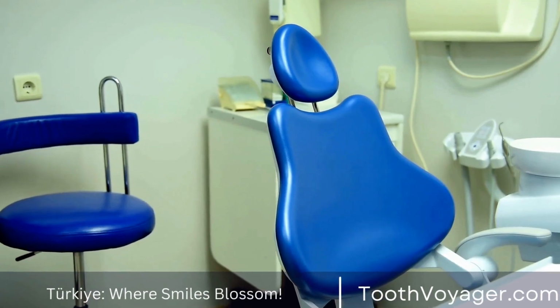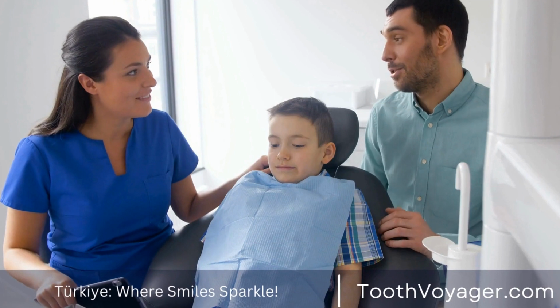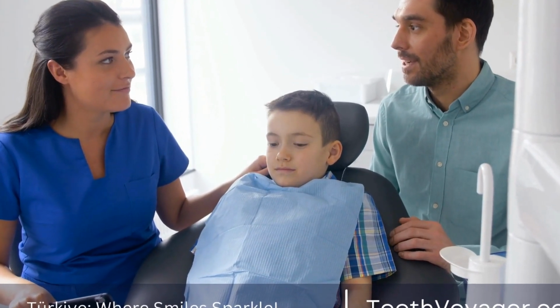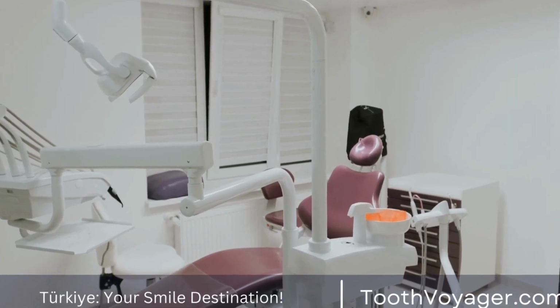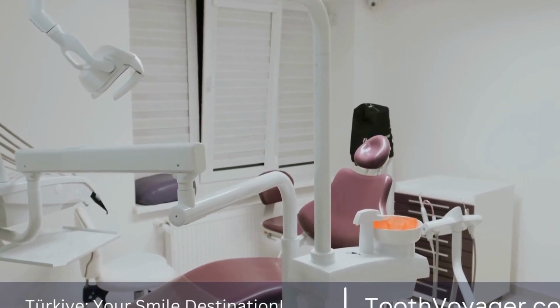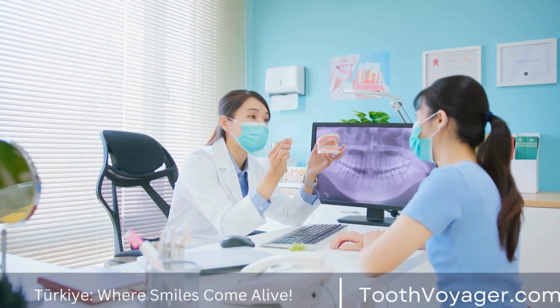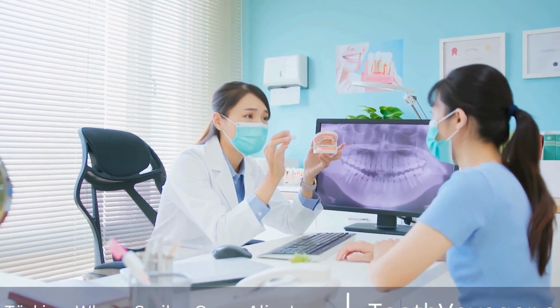Implants are a well-known and efficient solution to replace missing teeth. Implant dental treatment involves two major phases, osseointegration as well as final restoration. In this short video, we'll discuss the two phases in depth and what they do to the effectiveness of dental implants. Osseointegration is an essential process for implant dentistry where the implant is fused to the jawbone.